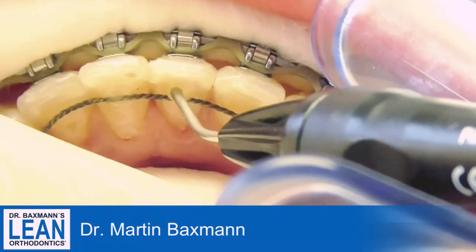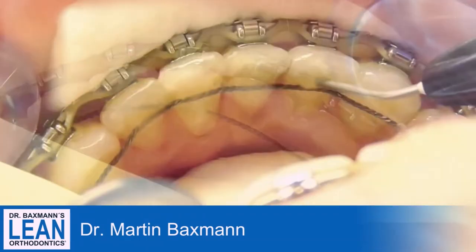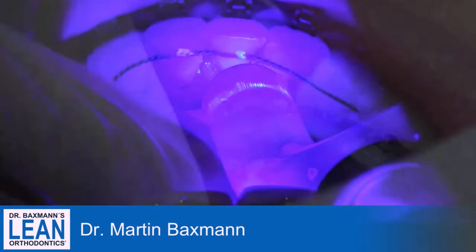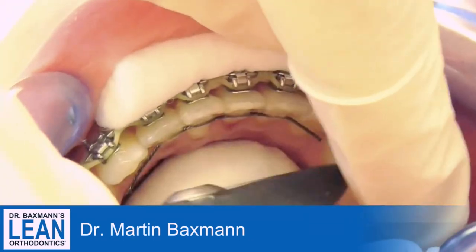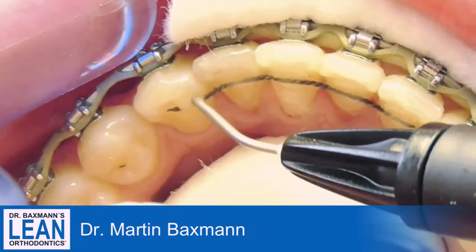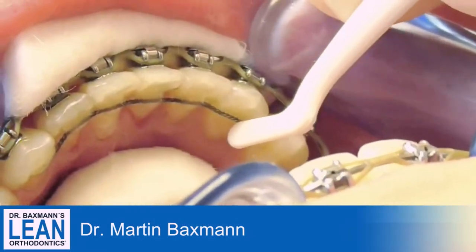We use indirect placement of the wire with some caps on the fours, which will hold the wire in place nicely. Then you put on your composite — something like Tetric Flow, a flowing composite that's very simple and easy — and then you cut the remaining part distally of the threes off, where you had the cap before to hold it in place for indirect bonding.